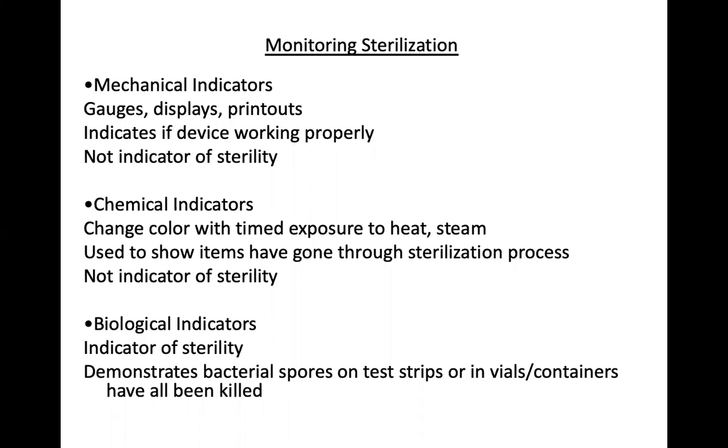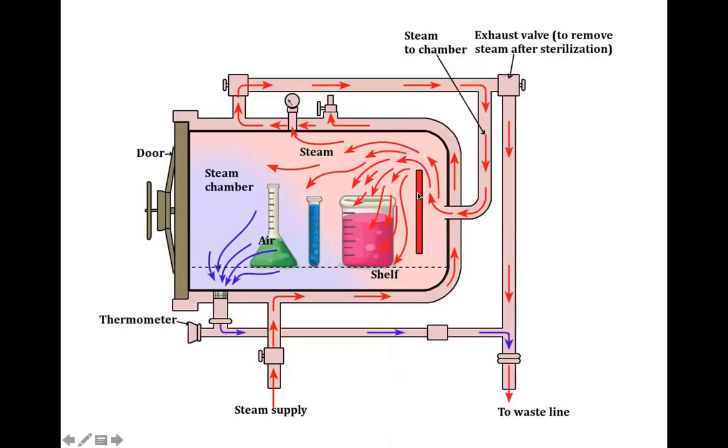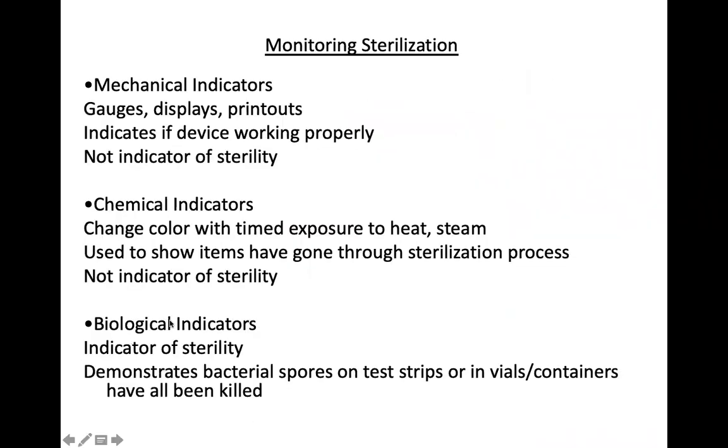Then you incubate. If you did not kill these bacterial spores, they are going to germinate. So it means that the sterilization process you carried out did not actually kill the microorganisms that were present, because the vials that you included as a quality control standard have actually germinated. The spores that were in the vials have germinated. And if you incubate them, you inoculate the spores onto the agar, and they don't grow, there's no germination, meaning you actually managed to kill the spores. That then is a quality control indicator, which is biological, that is an indication of killing microorganisms.